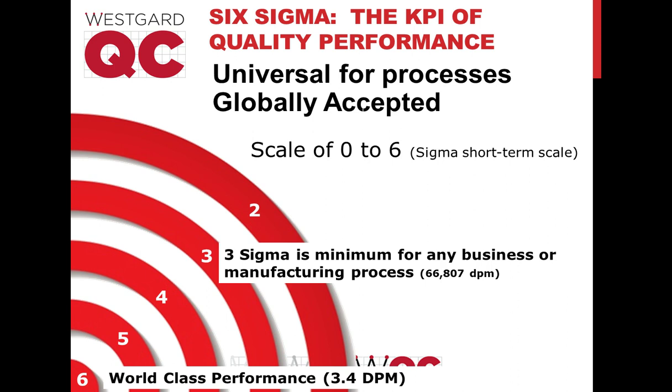So regardless of the status of the instrument, whether it's waived, non-waived, whether it's moderately or high complex, we encourage the same best practice, which is determine your own standard deviation, determine your own mean, try and do some regular checking against some external source. You want to do proficiency testing and external quality assessment. Use that imprecision, use that bias to help you determine a sigmametric. If it turns out, yes, I have a 6 sigma method, and it tells me I could reduce my QC frequency to once per several thousand patient results, if that happens to go along with the manufacturer's recommendations, that's great.